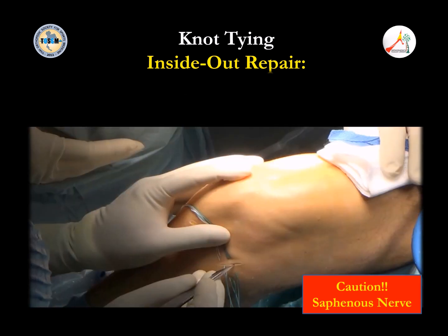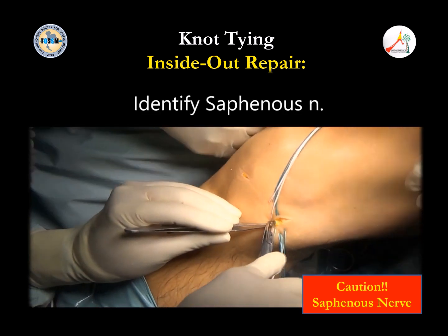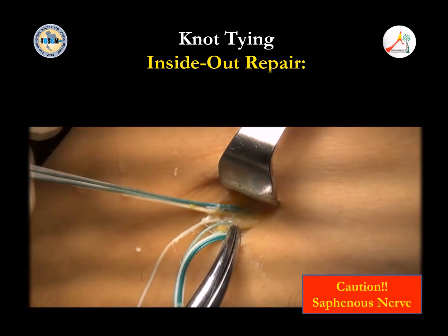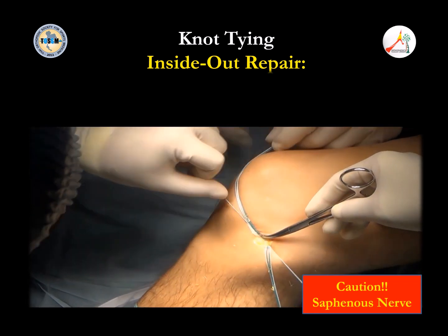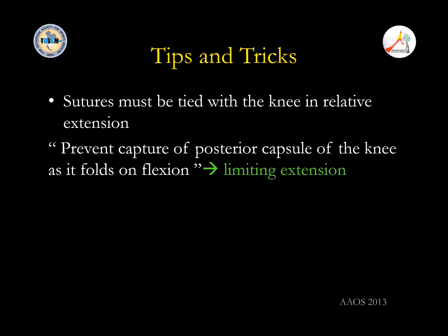And then after that, you make a small skin incision. Especially with very skinny patients, on the medial side you have to be careful of the saphenous nerve. There are two branches, the sartorial branch and the infrapatellar branch of the saphenous nerve. Make sure that your suture is not tied over the nerve. The patient will have so much pain, like a neuroma on the medial side. Identify the nerve, tie on the capsule, and remove all the fat tissue. So just a small incision, and you tie the suture later after you repair.